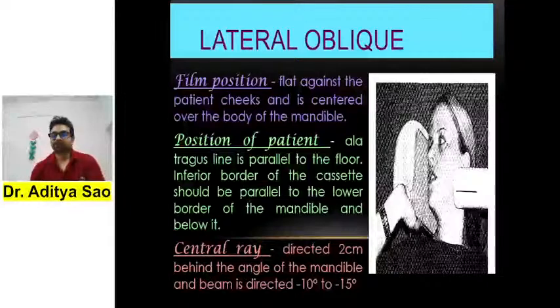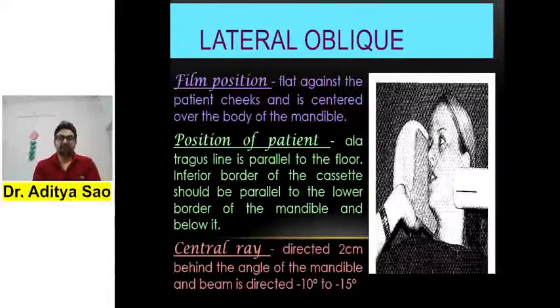Then comes your lateral oblique projection.